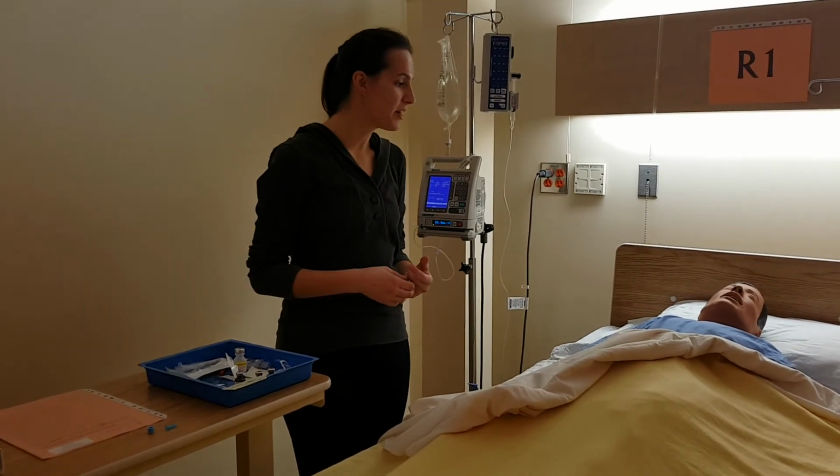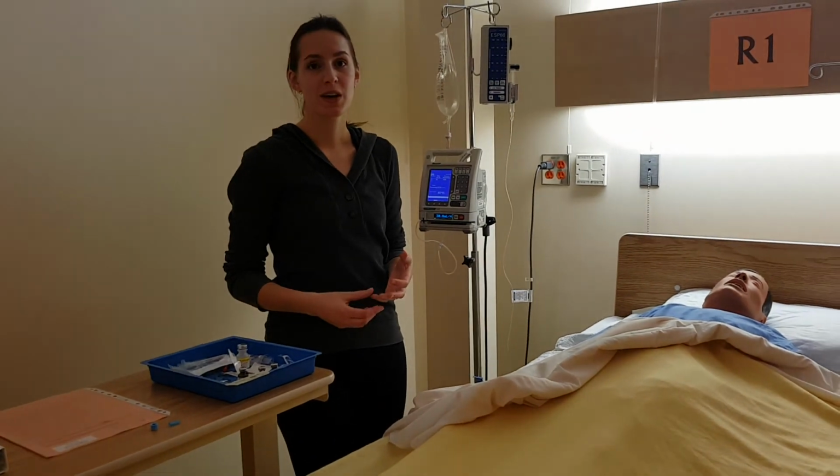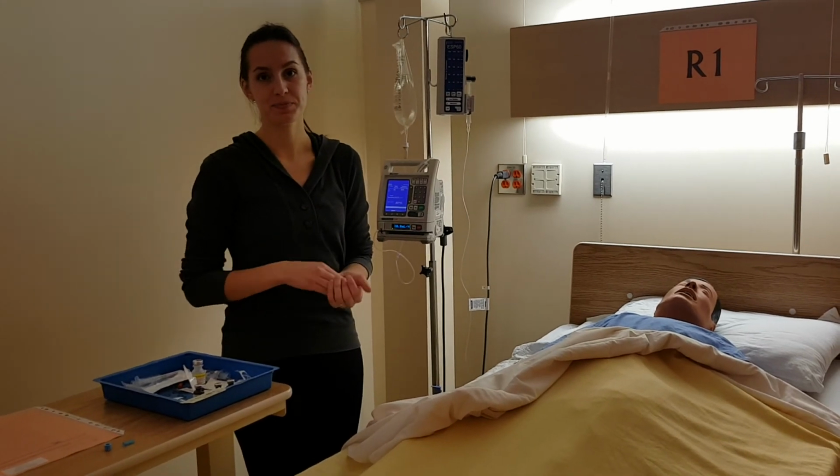And I will continue to monitor for improvement of my patient's symptoms by looking at their lab values, doing vital signs. I would do vital signs before I give this medication as well as after this medication.